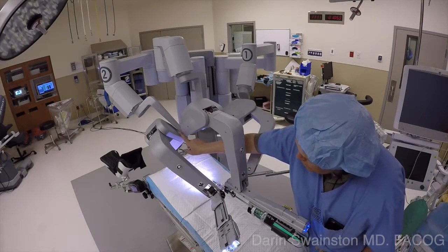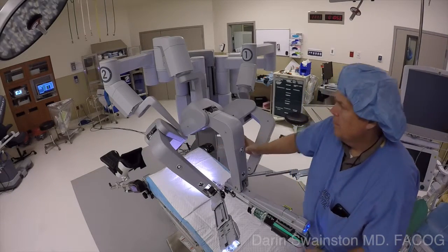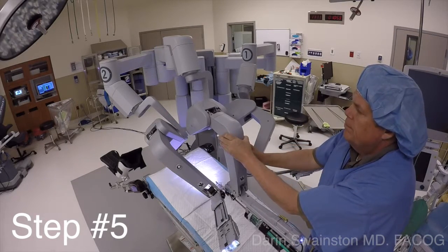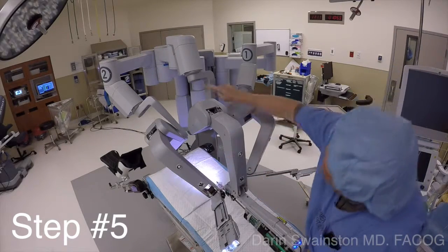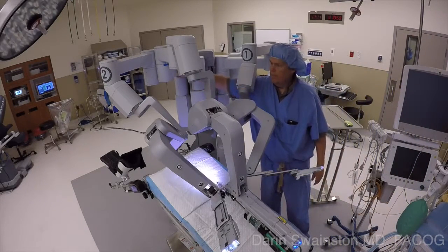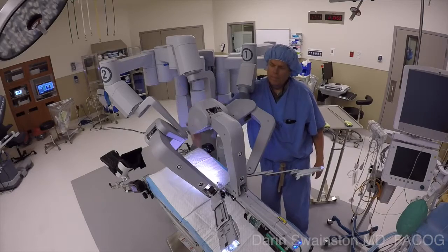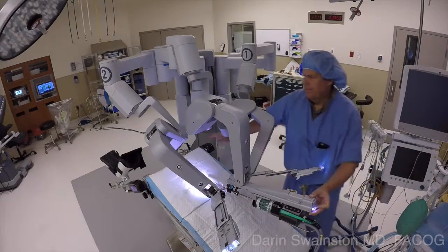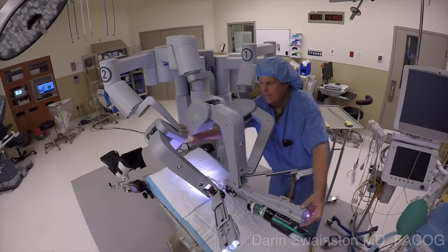At this point, take the camera arm and turn it to the right just enough to create a space between arm number two and the camera arm. This way, when you rotate over to the left side to operate on the left adnexa, you won't have external collisions. Operating on the right side doesn't really give you collisions unless you go way up high — it's that left side, as you see my hand showing.